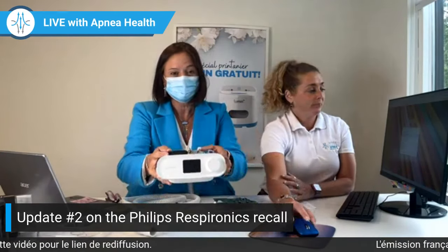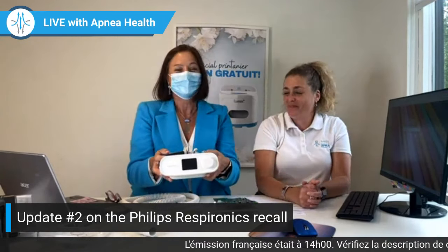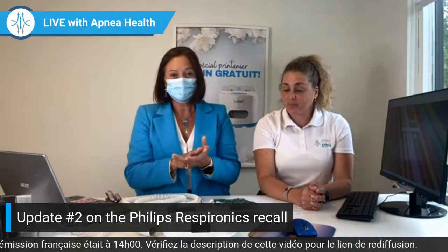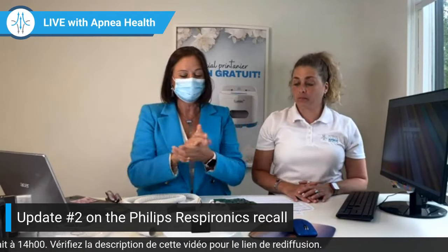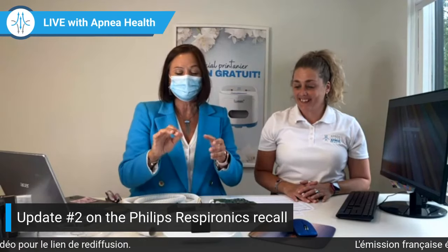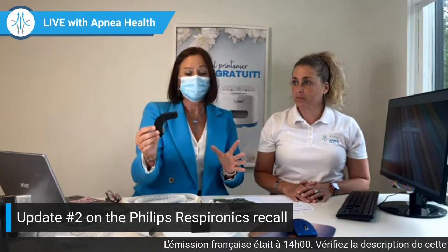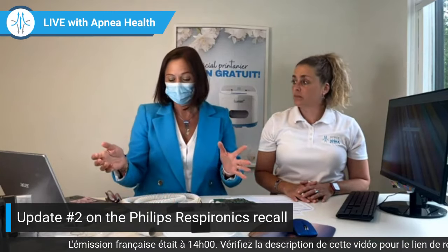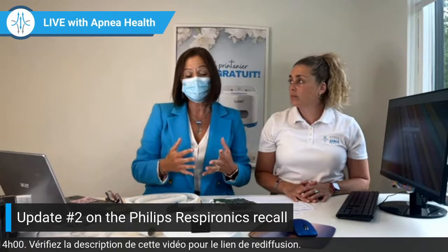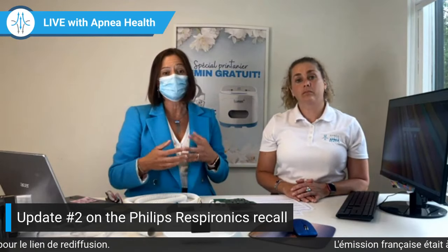I have one of these CPAPs in my bedroom. It's my little buddy. I sleep with it every night. My second lover, or my first lover. And I have not used ozone. I haven't taken it to Hawaii with me for long periods of time. Would have liked to. But I'm continuing to use it because the foam is fine. I don't have any bits anywhere in my water chamber, in my tube, in my mask. Everything is fine. So I'm really going to continue to use it until Respironics is ready to swap them out.